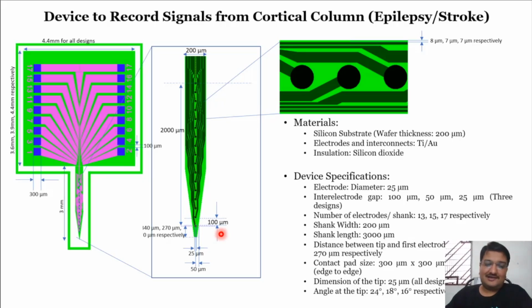But all this is possible only when you know the fabrication. For that, there are microfabrication techniques, which include thin film deposition, which basically has physical vapor deposition and chemical vapor deposition. For physical vapor deposition, thermal evaporation and e-beam techniques have already been explained in the course. For etching, there are different kinds of etching.